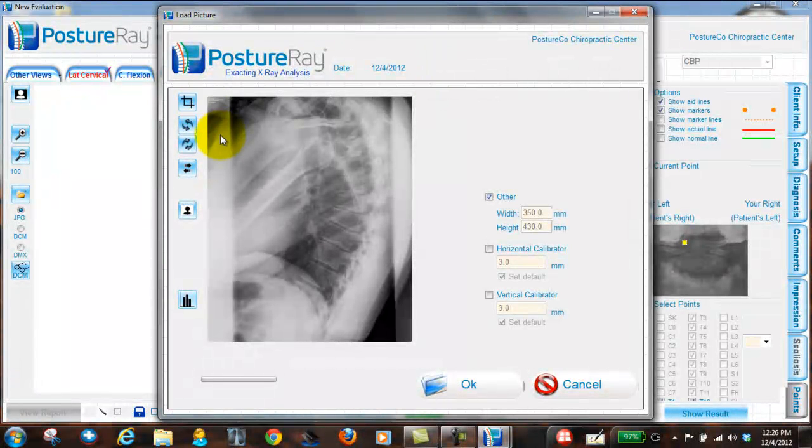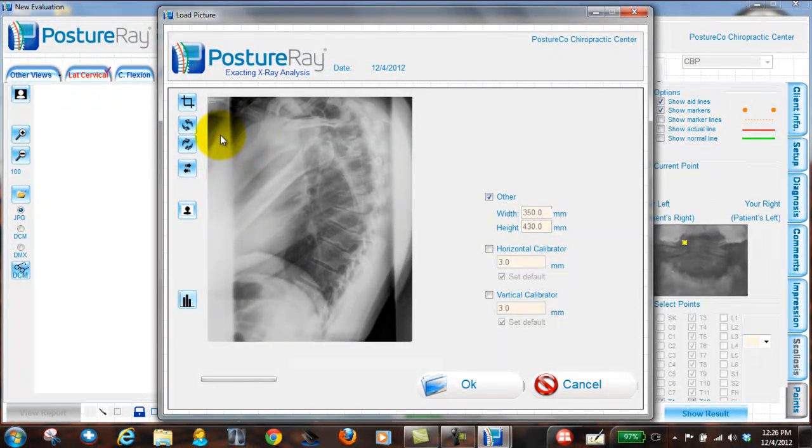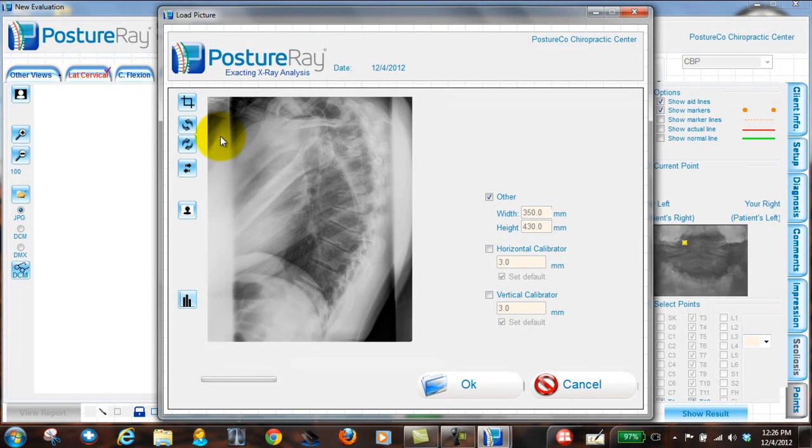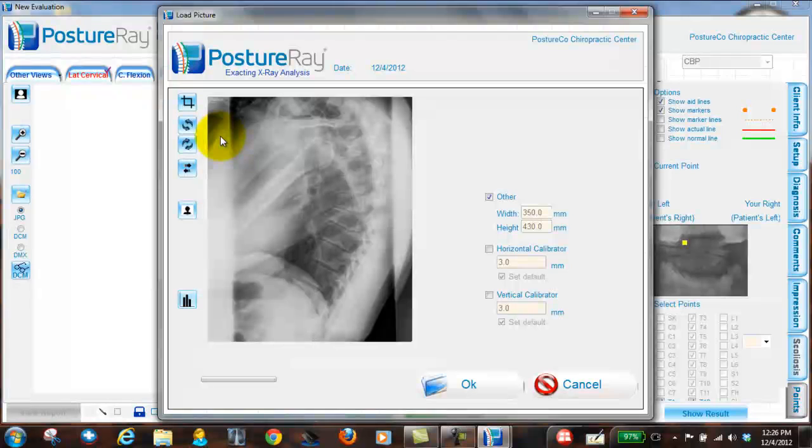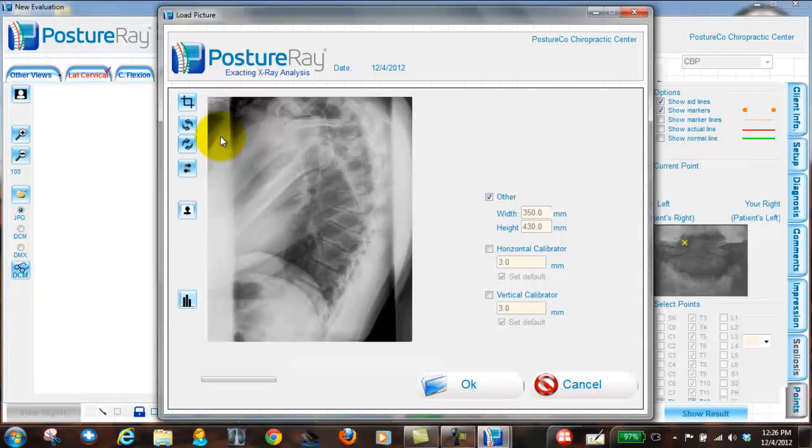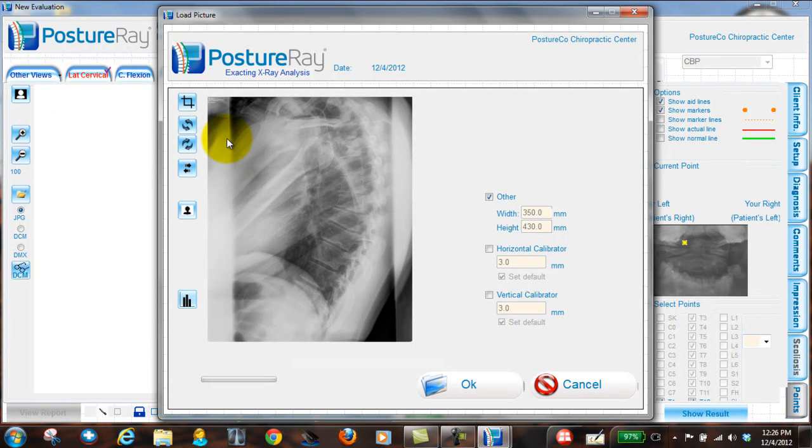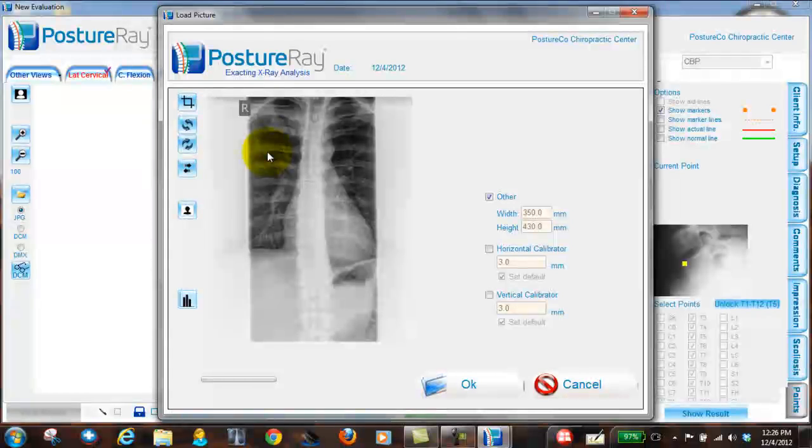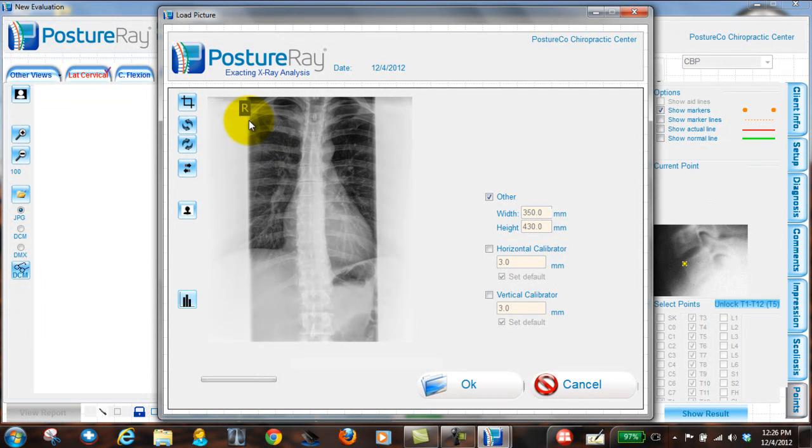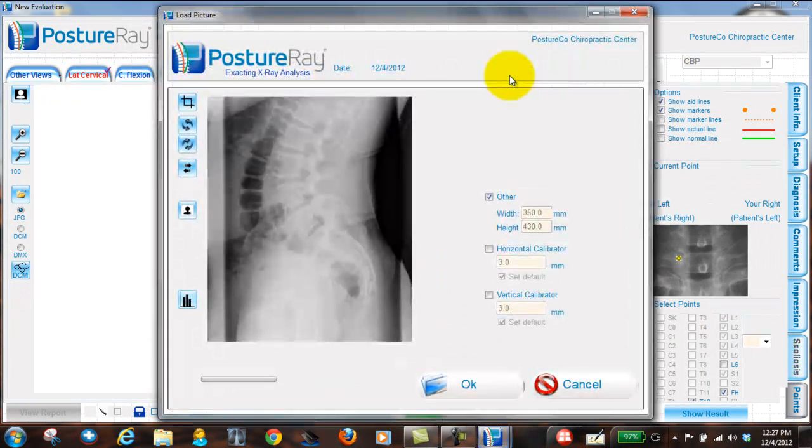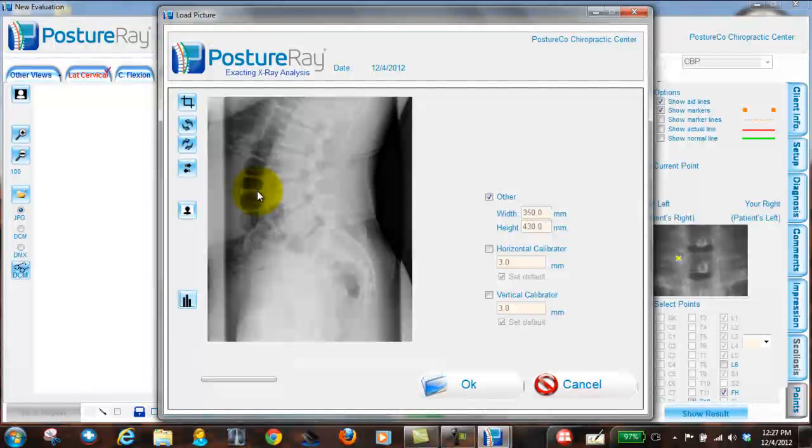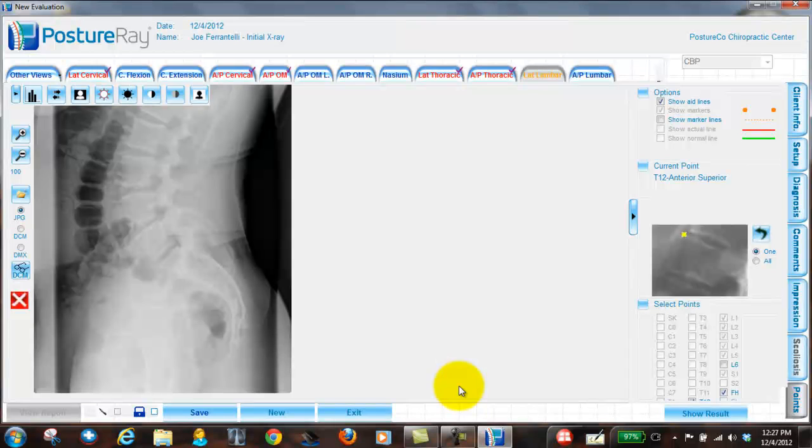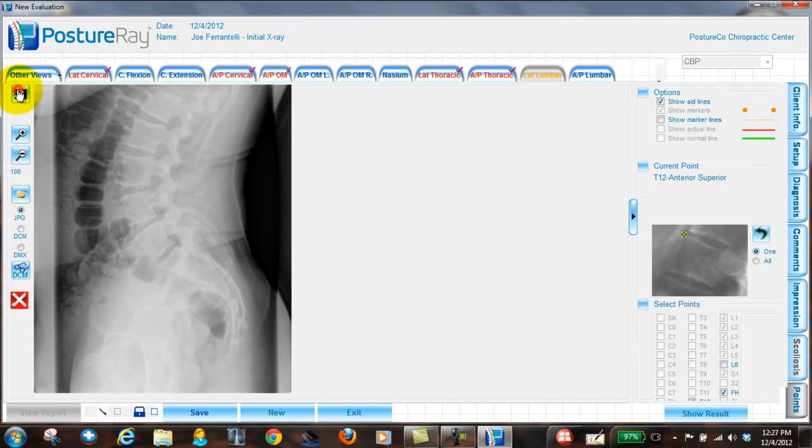And notice that we got the APOM. Notice that these are all need to be verified. We always want to face the lateral views to our left. I'll explain why as we go. But they're always going to be facing to the left. It doesn't matter if the doctor wants to view X-rays to the opposite side. You do not get a choice. Because it doesn't really matter when you're digitizing anyway. If the doctor wants to view the images when they're done viewed backwards, that's not a problem. We can, of course, flip the images. And we can export them flipped. So the doctor, if they're used to looking at them anterior to the right, that's not a problem. But for digitizing purposes, you always will load the films this way with the right on the doctor's left or the CA's left. And we're going to make sure the laterals are all facing the left anterior. So that is how to load images using the DICOM format.